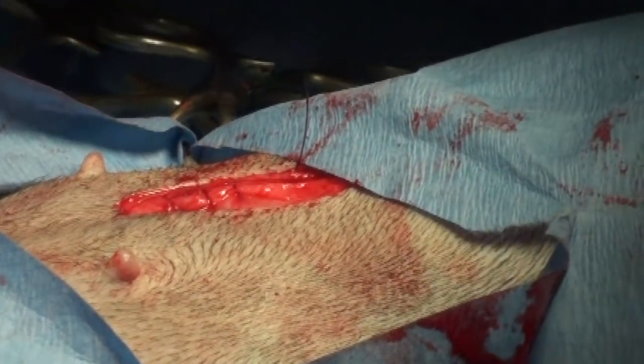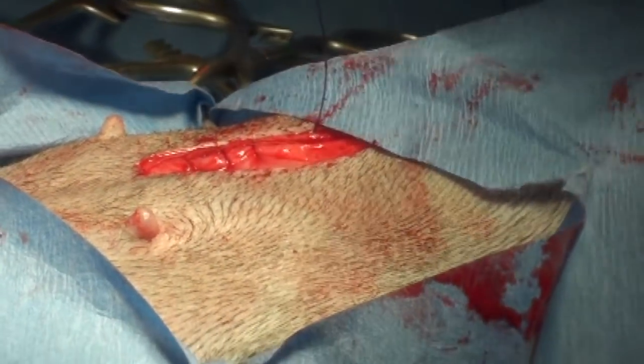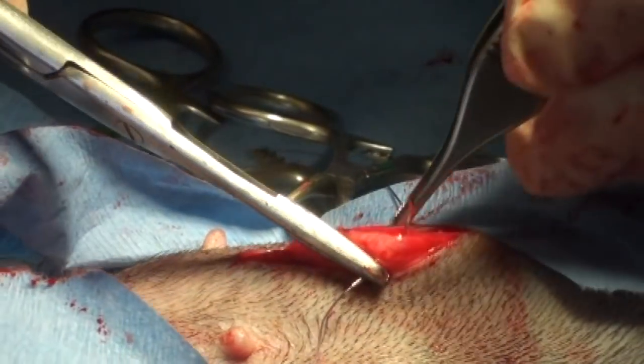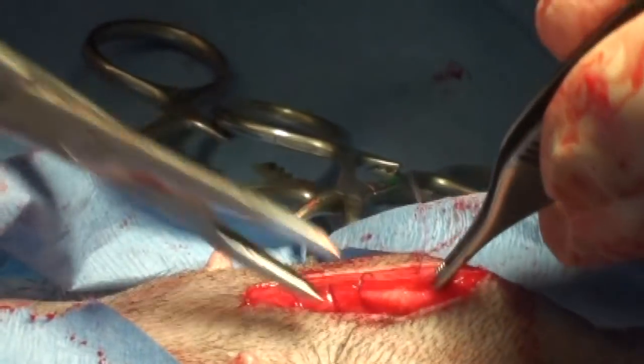You can see that's seating nice. Notice I'm not pulling too tight because we want it to heal. We don't want to pinch the blood vessels off, cut off the blood supply.